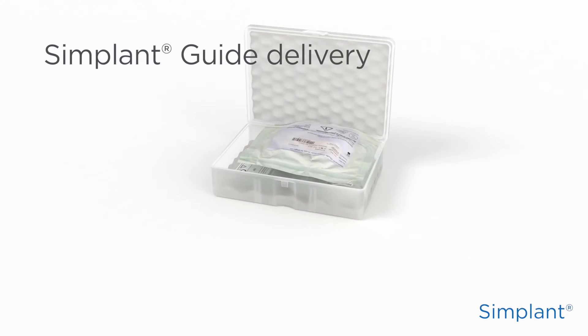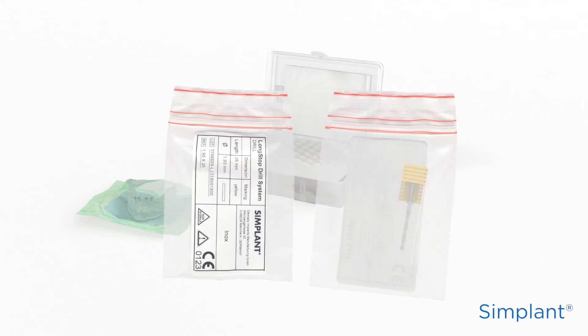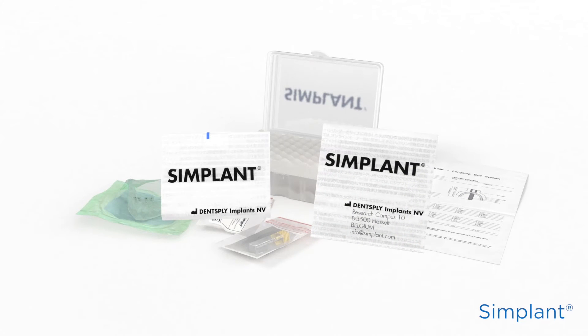Let's start when you receive the Simplant Guide. Your Simplant Guide will be delivered in a box, together with instructions for use and a patient-specific surgical guideline.